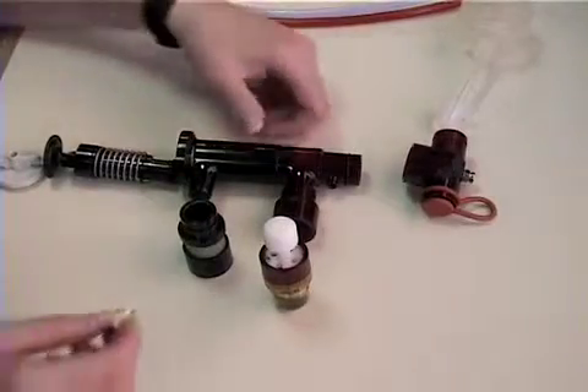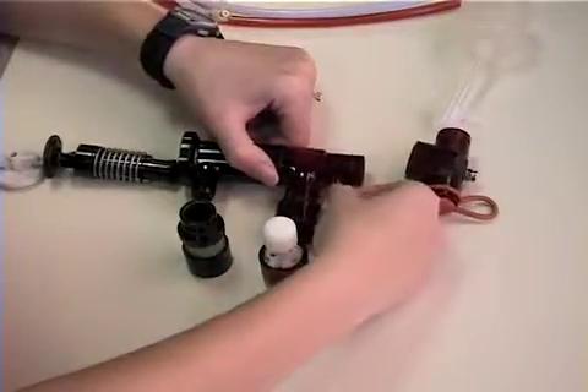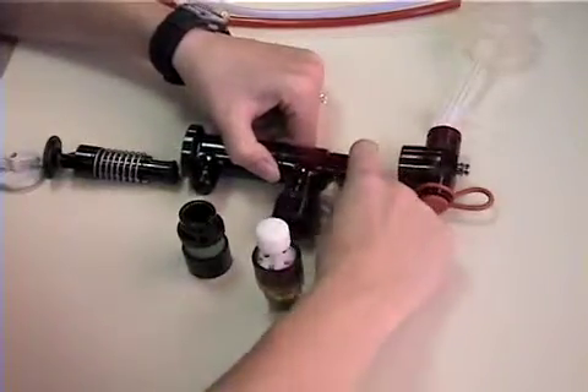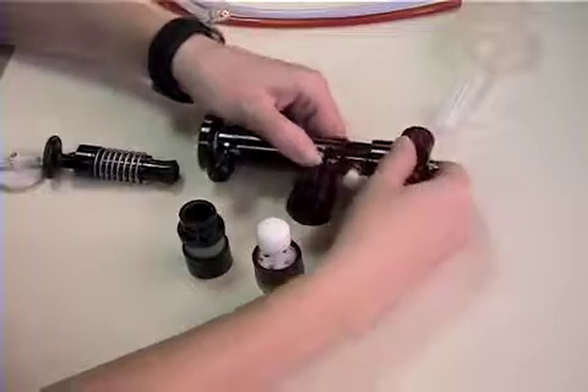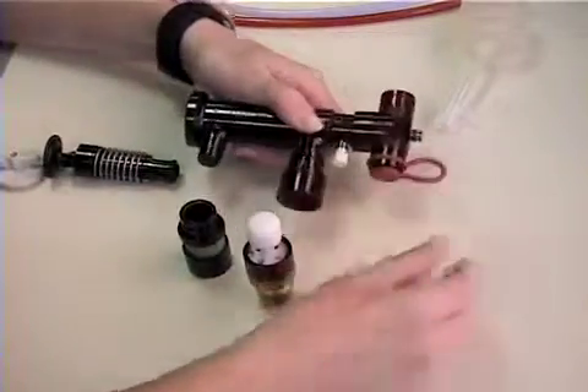The assembly is illustrated here. The white cap is placed on the monitoring port. The endotracheal tube assembly with the proximal airway port is placed next.